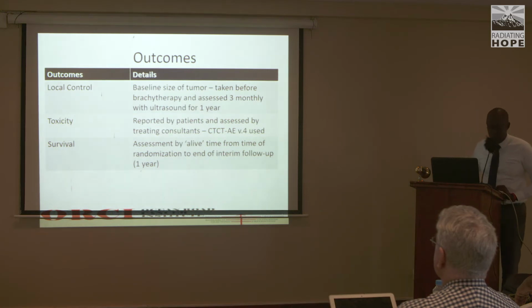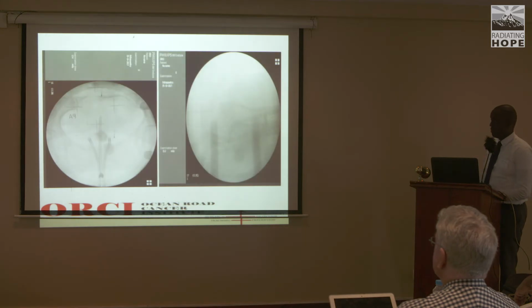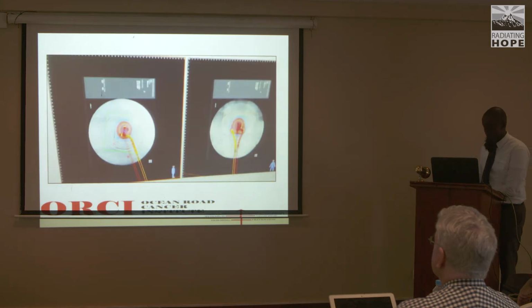At the level of brachytherapy, this is how the images would look: basic tandem and ring applicators, with the anterior-posterior and lateral views. And then at the end, after planning, this is the image you would have for placing dwell points all over the applicators and having your rectal and bladder points defined.